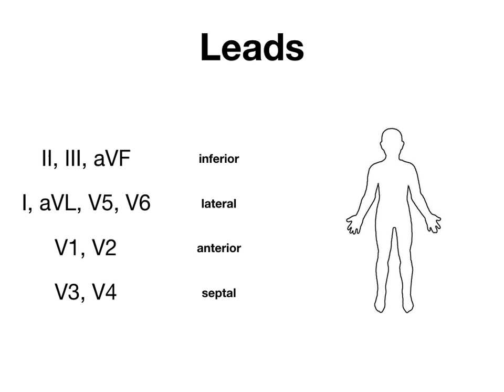When I was a medical student, it didn't really make a lot of sense to me that where the leads were in space corresponded to different parts of the heart. Now, if you're going to be a cardiologist, maybe you understand that geographic orientation, but I didn't go into cardiology. So I needed a different way to memorize this. How I did this was with a few mnemonics.